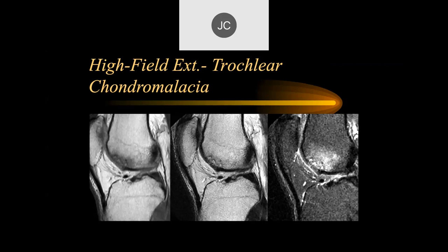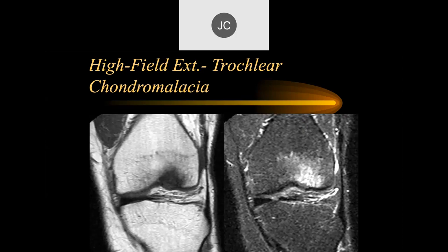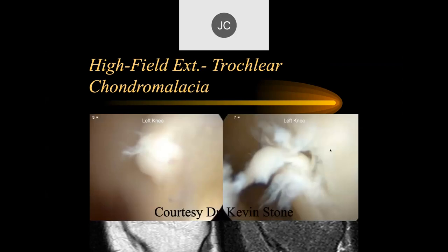Here we don't really see a full thickness defect within the articular cartilage in these images. On the axials, there's a lot more irregularity of that bone suggesting full thickness defect. What does this look like at arthroscopy? At arthroscopy, this is what it really looked like — very degenerated, loose, unstable articular cartilage with full thickness defects, all kind of crab meat here.